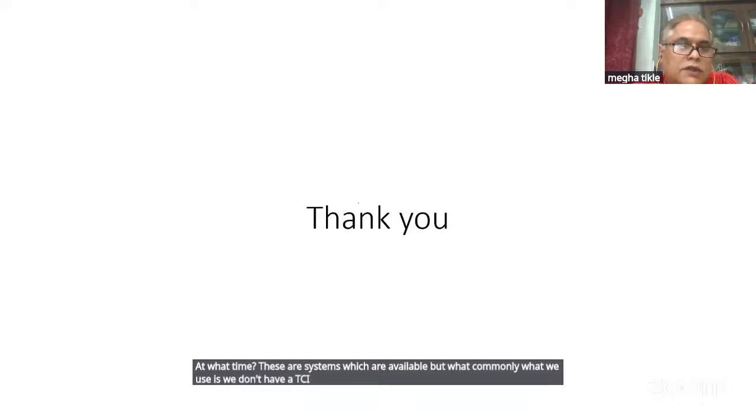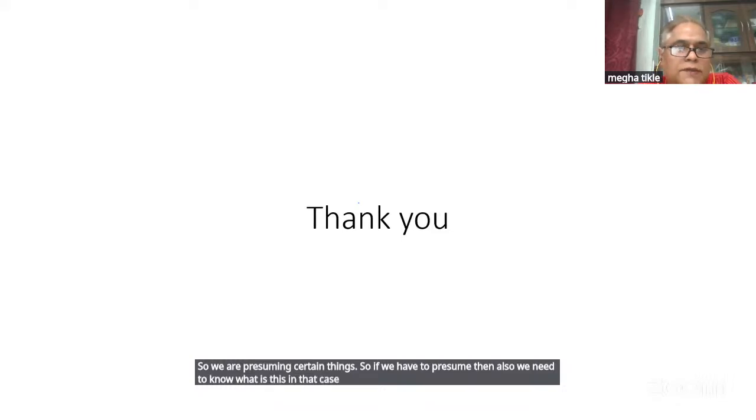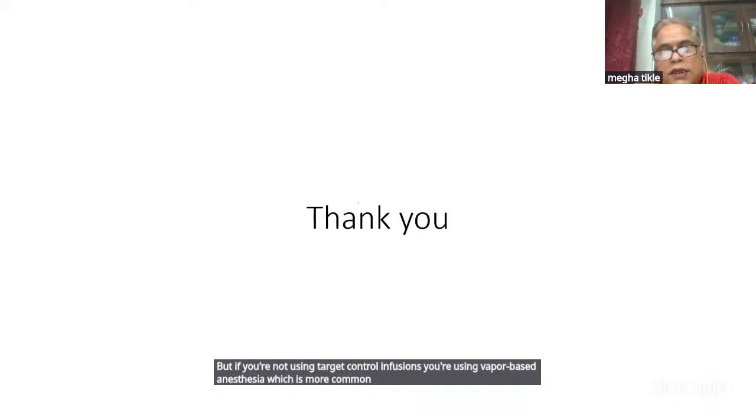At least I have not seen in many places in India where target controlled infusion is matched with BIS or entropy, or is connected to that entropy with a feedback loop system. So we are presuming certain things. So if we have to presume, then also we need to know what is BIS. So in that case, you need a BIS monitor. But if you're not using target control infusions, if you're using vapor-based anesthesia, which is more common in our country, then respiratory gas monitors are more important.